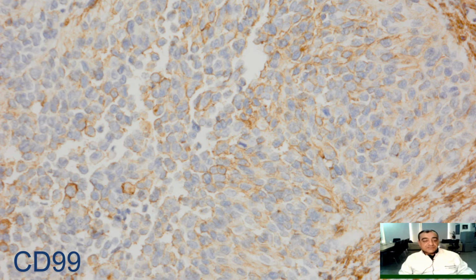Another marker which can make things complicated and create a mess is CD99. We know that CD99 is a specific marker for Ewing sarcoma, but it is not completely specific because it can be seen in other entities also, as shown here.